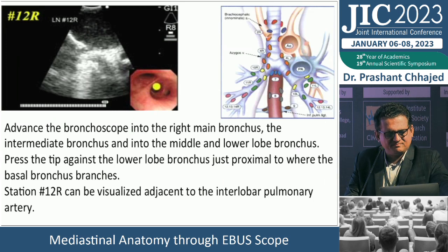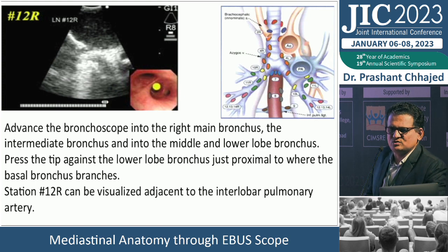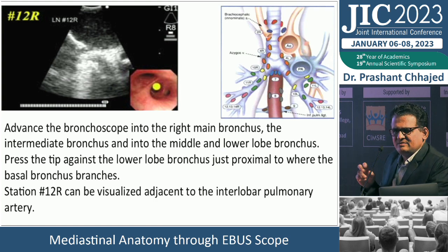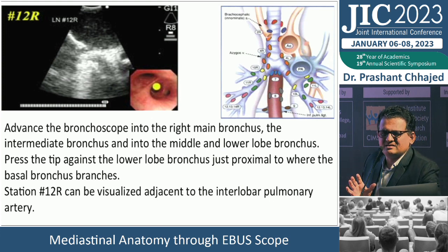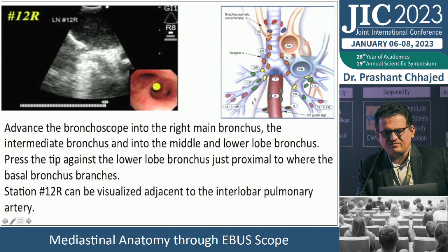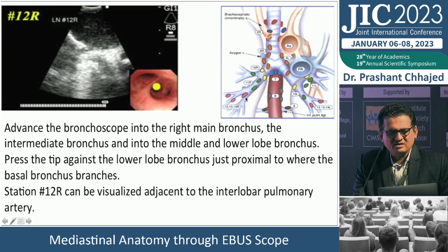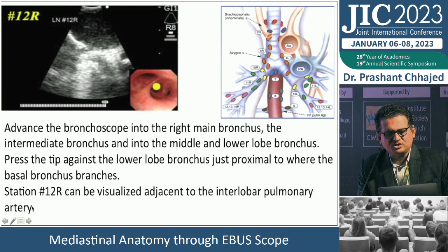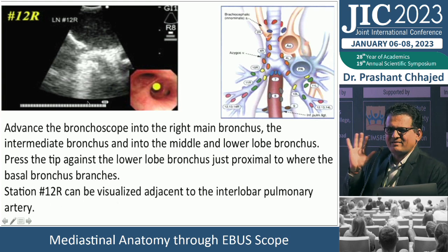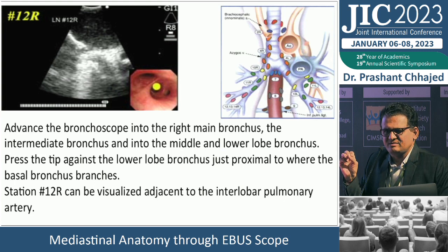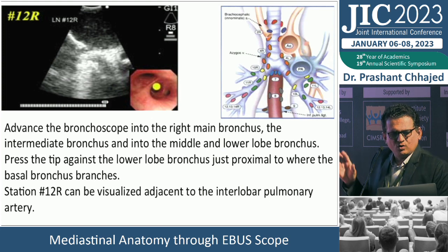Moving to mediastinal anatomy: after white light bronchoscopy, insert the scope directly into the right main bronchus, look at the intermediate bronchus, and advance into the lower lobe bronchus. For station 12, press the tip against the lower lobe bronchus just proximal to where the basal bronchus starts to branch — station 12 can be visualized there. For station 11, straighten and withdraw the scope into the bronchus intermedius, turn to the 2 o'clock position.